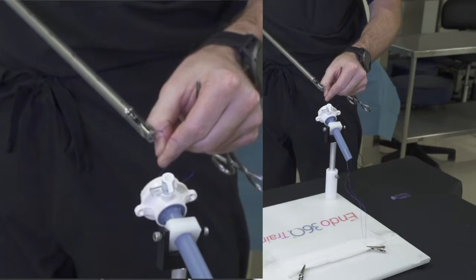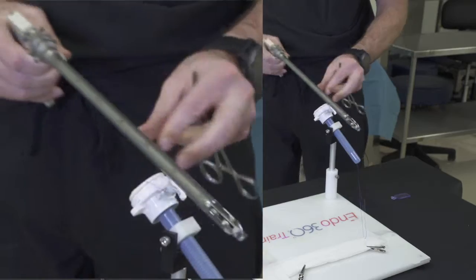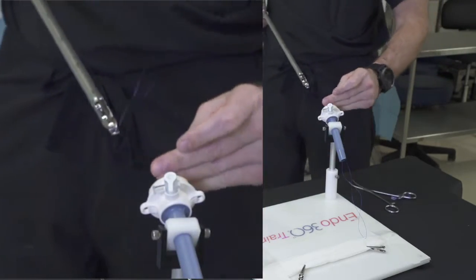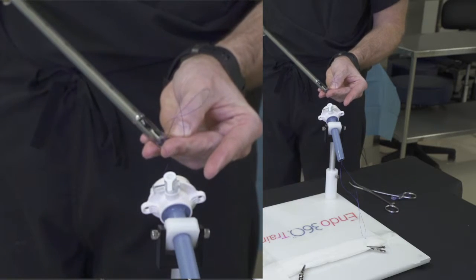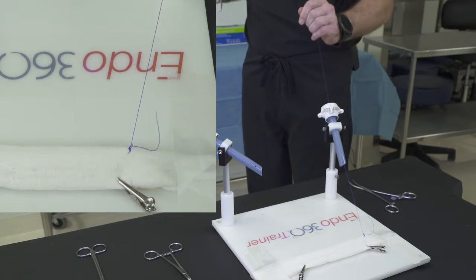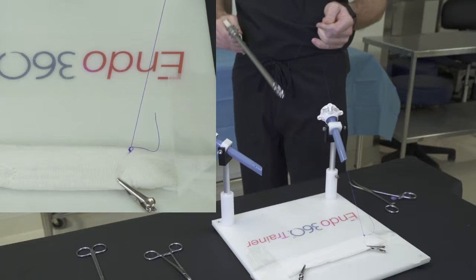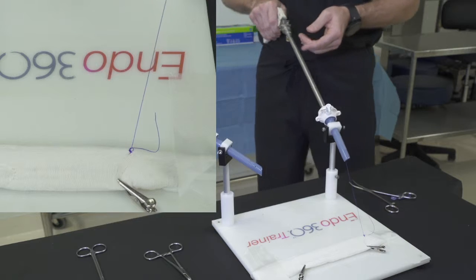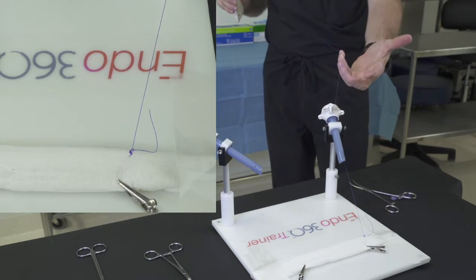Now here I'm on the outside of the patient, and what I'm going to do is I'm going to feed the needle, or thread the needle, into the eye that I created. And then I'm going to pull this down so that it locks it in place. So that's the first suture. We're not doing any intracorporeal tying. That's an extracorporeal knot.